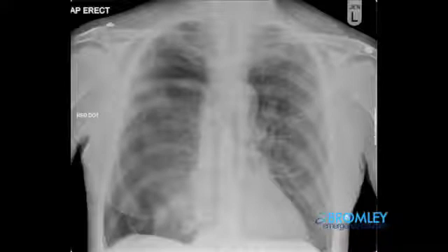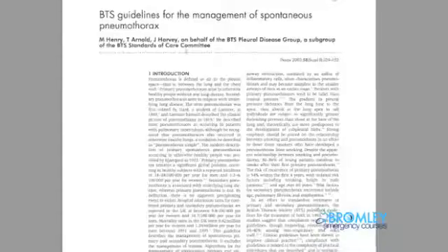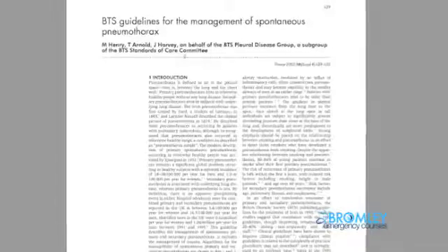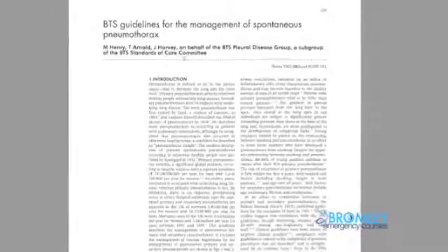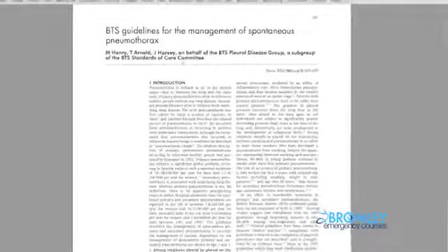Though this may be a relatively straightforward procedure that you may have performed in the ED many times before, it is important to be as thorough as possible in the examination. Take some time to familiarise yourself with the equipment seen above and the anatomical landmarks necessary for this procedure. Finally, before even viewing this video, it is important to have a good understanding of the BTS guidelines for the management of a spontaneous pneumothorax.